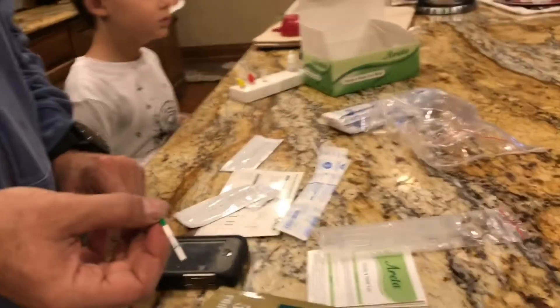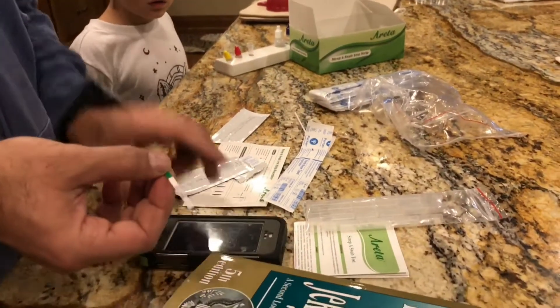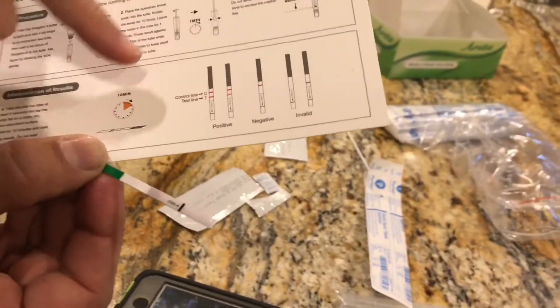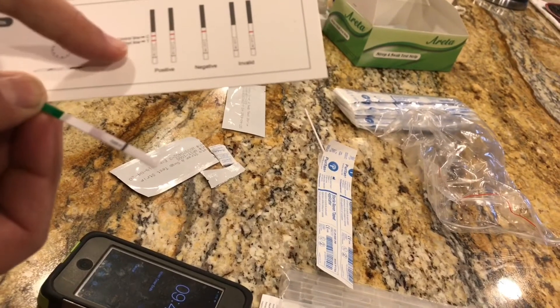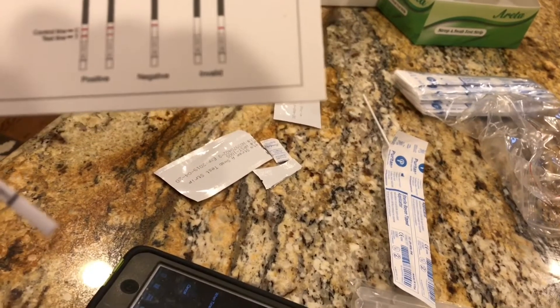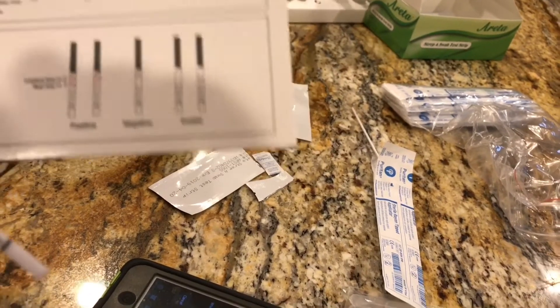The last one I did changed well before 10 minutes. What we're looking for is two lines. There are two little pink lines above the black line. If only the control line is pink and the second line is not there, that's negative. But if both lines show up — two hash marks — then you have a positive strep test. We'll come back and look at that in a bit.